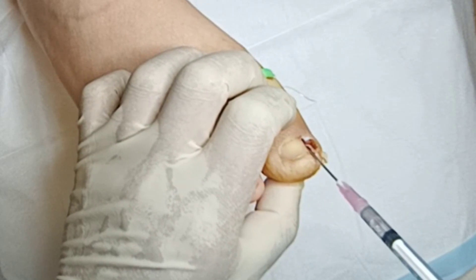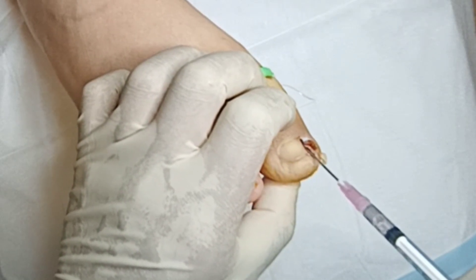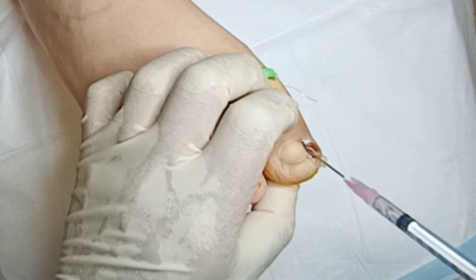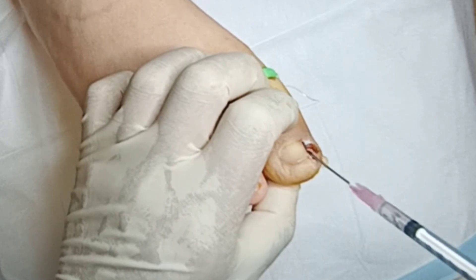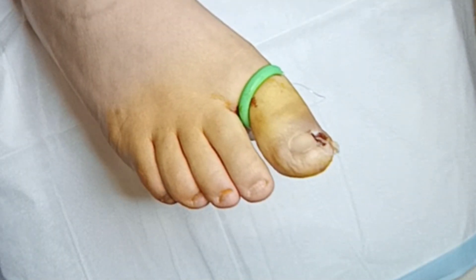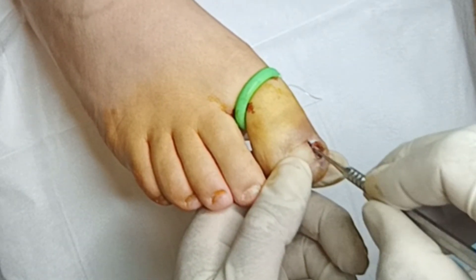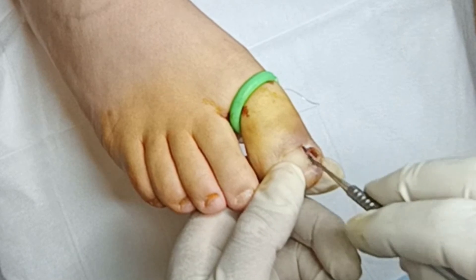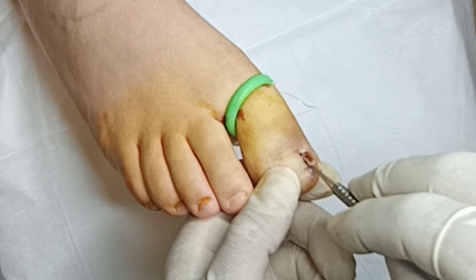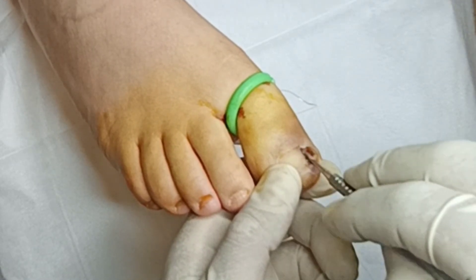I'm going back a third time because I've noticed some areas where the acid hasn't reacted much. You're just literally touching, and you need a very small amount. I don't tend to use earbuds because they absorb a lot of the acid and make a mess. As you can see, the acid isn't spreading everywhere — I'm keeping it very localized to avoid phenol burns and other complications that can occur. Massaging it in, making sure it's reaching all the areas.